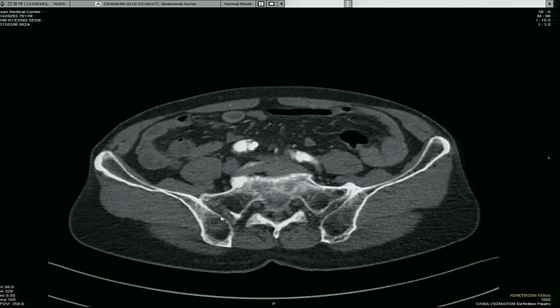Okay, you can see right here there's some disease, like a small contained dissection or maybe an ulcerated plaque in that right common iliac. You see that, Bob? Yes, we do. We see it very well. Yeah. So our intent is to cover to the hypogastrics and eliminate all this disease.